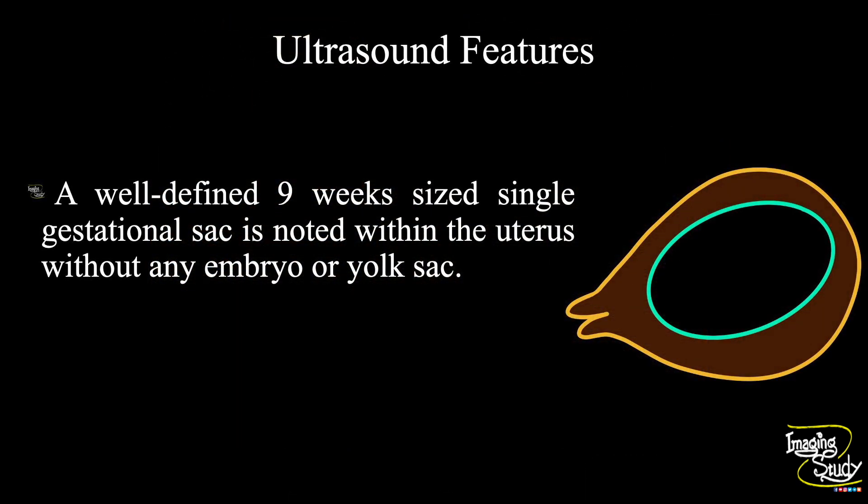In summary, a well-defined nine-week sized gestational sac is noted within the gravid uterus without any internal embryo or yolk sac. Both adnexa appear normal. So the diagnosis is blighted ovum.